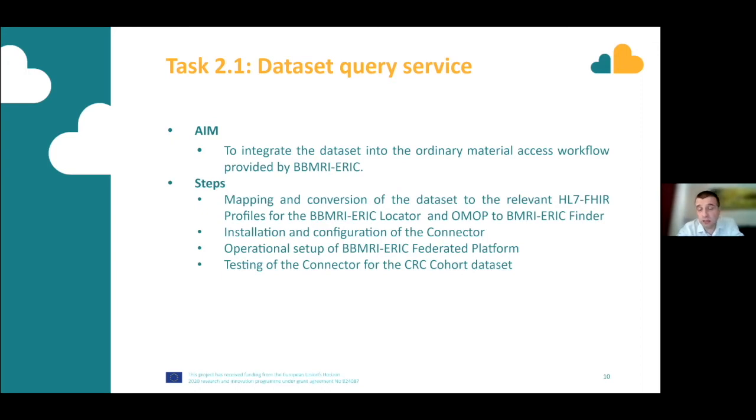And at the moment, it comprises two systems, a locator and a finder, each of them working on slightly different data standards. So the locator works with FHIR and finder works with OMOP, which is actually a good test case for us for the integration and for the conversions.